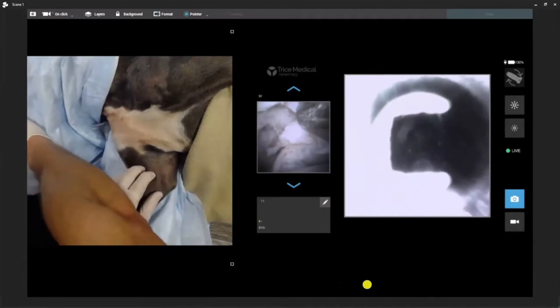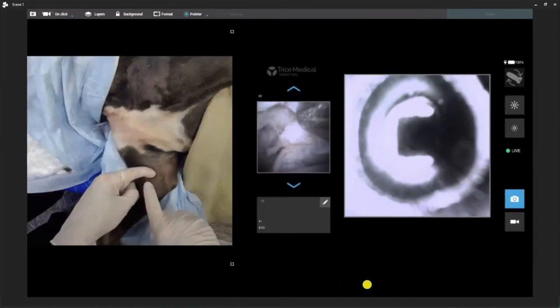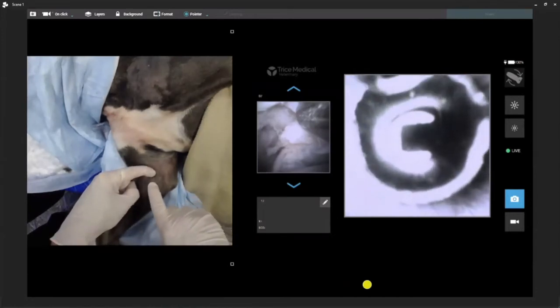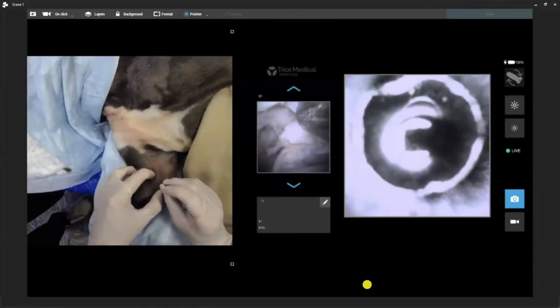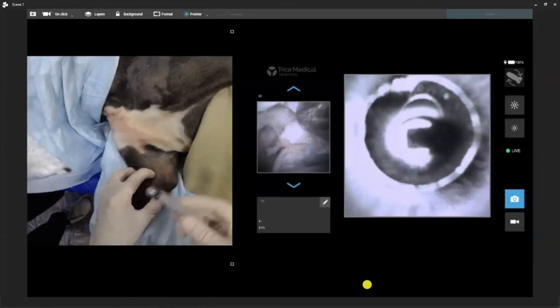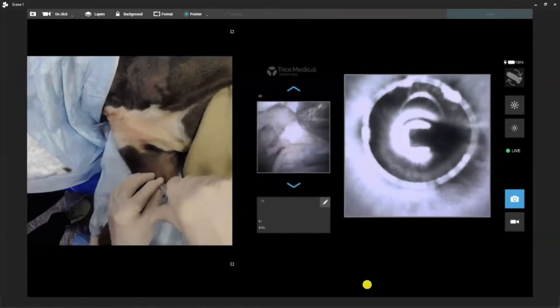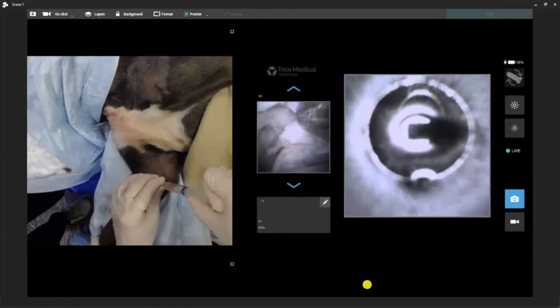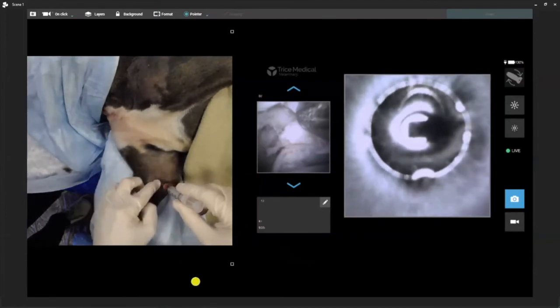We're going to take our needle. So our epicondyle is here, that means our radial head is going to be here, humeral condyle, and our ulnar notch is going to be in this group. We'll take our 22-gauge needle with a 1.5-inch length and slide directly into the joint. A 5cc syringe — apply that to the needle, aspirate, and you can see our flash. Hopefully you guys can visualize that. So now we know we're in the joint 100%. I like my landmark — about a finger's width from the epicondyle.